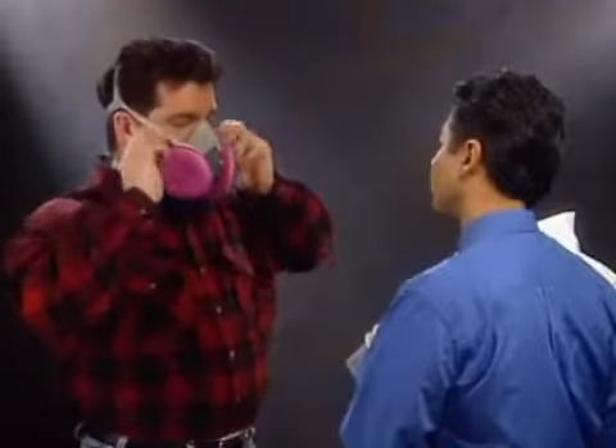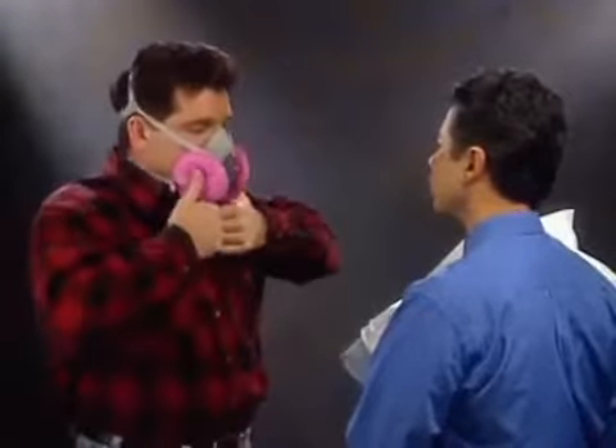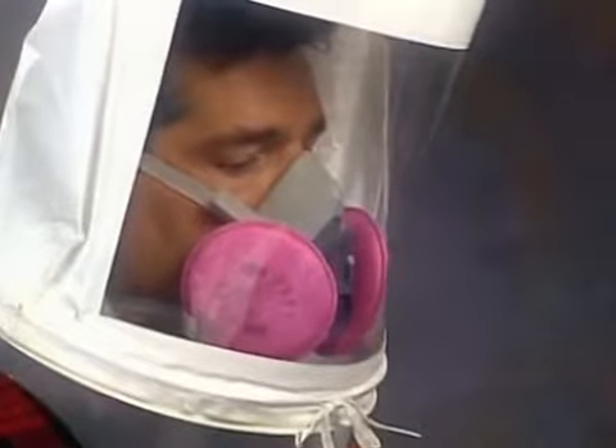Next, put on your respirator following all instructions for proper fitting, including a user seal check as taught during your training session. The instructor will place the test hood over your head again and position it so that you have about 6 inches between your face and the window.